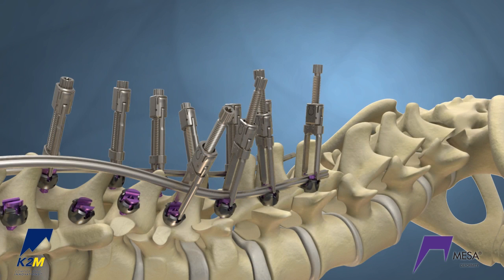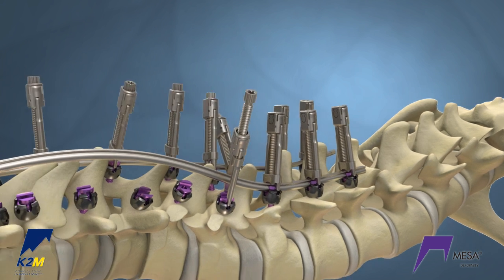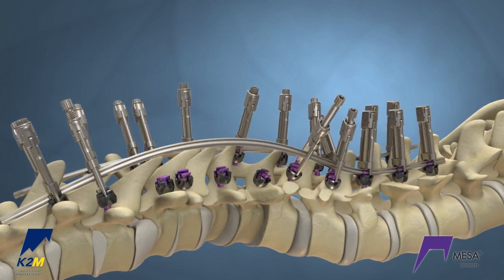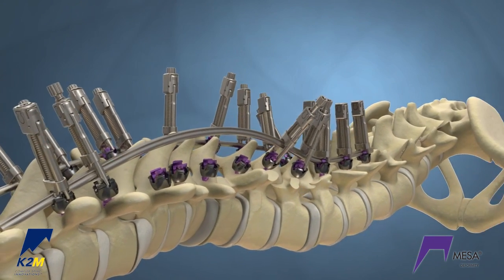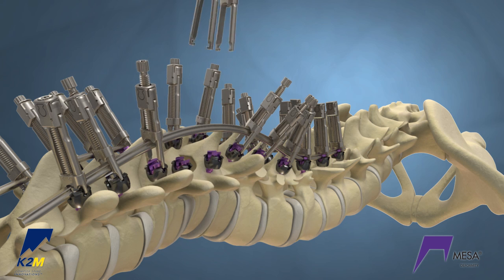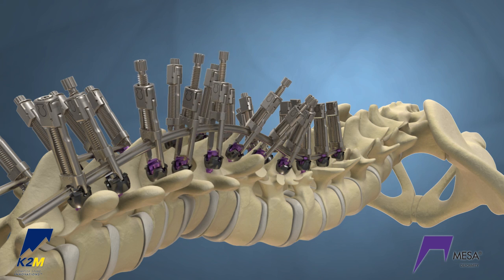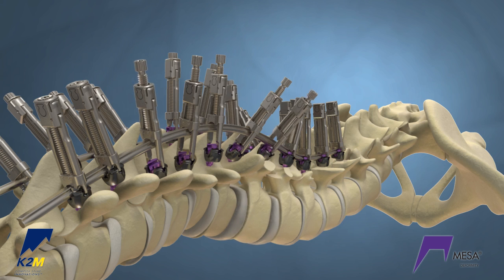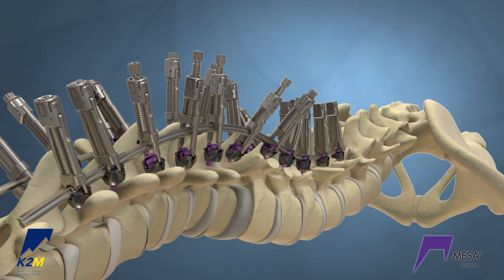On the concave side, fully reduce the bottom 3 crickets and apply some reduction to the top cricket. Then loosely add the remainder of the crickets working towards the apex. Once all the crickets are applied, slowly reduce the crickets working from the outside in, moving towards the apex. Reduction is done slowly using each cricket and moving to adjacent levels to avoid point loading on any one screw.